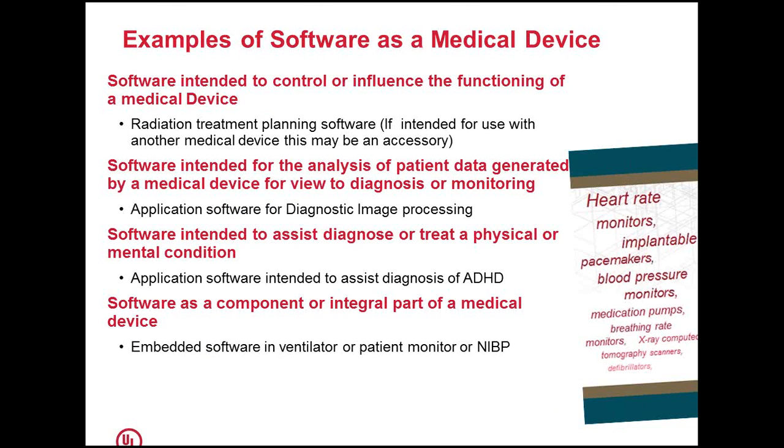Let us see some examples of software which are considered as a medical device. Software intended to control or influence the function of a medical device. For example, a software which is going to control the complete functioning of the medical device, including its performance and its related safety. A radiation treatment planning software.